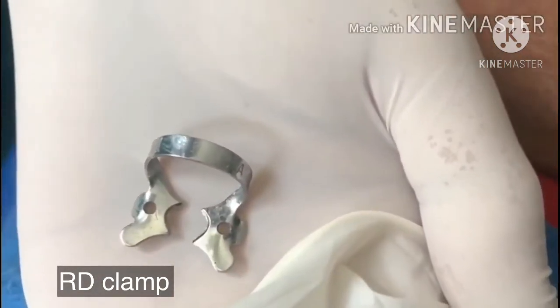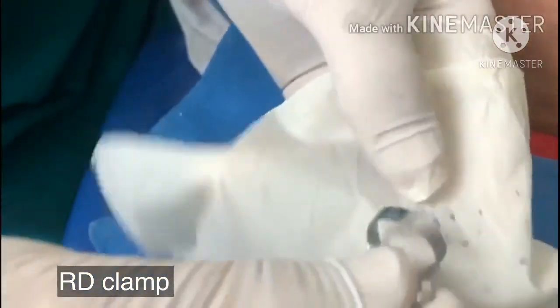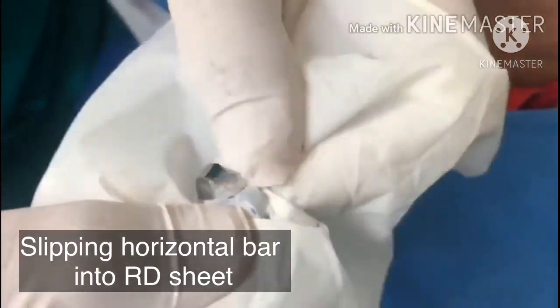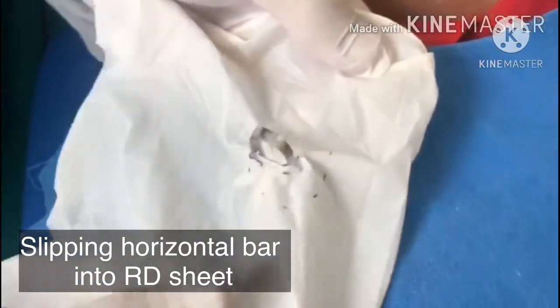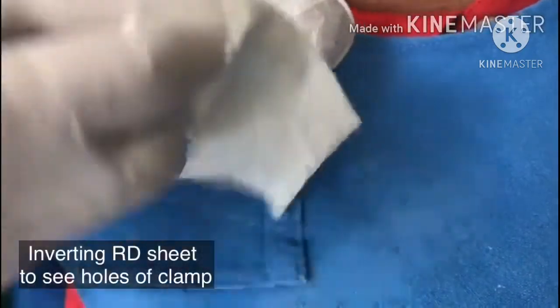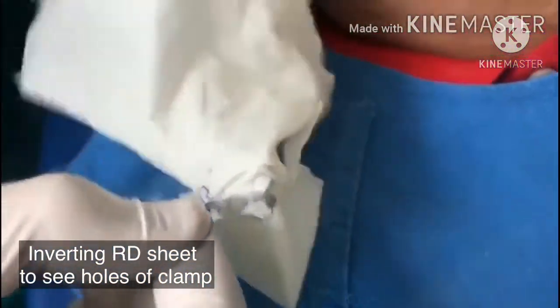So what we do is we place the horizontal bar below the rubber dam sheet and slowly spread it so that the horizontal bar is visible. Now we turn the rubber dam sheet — I will just do it for you like this. I am doing it very slowly so that you can grasp.